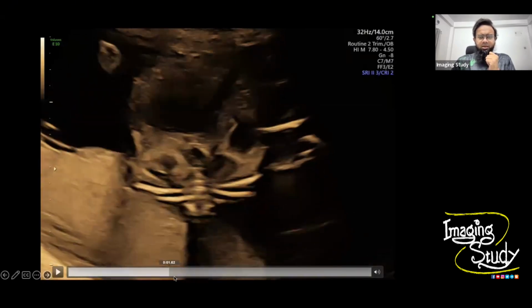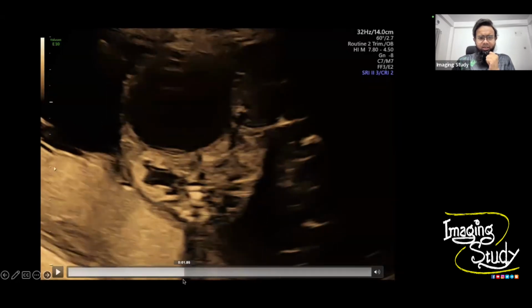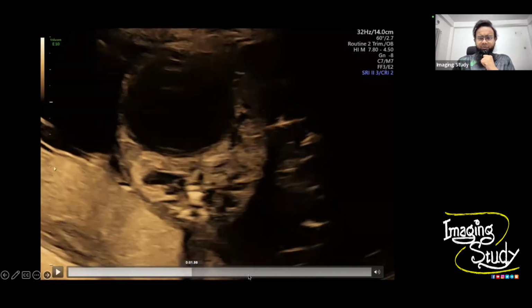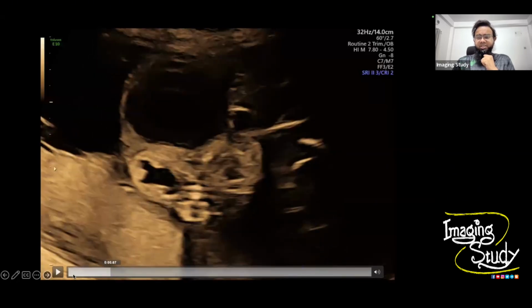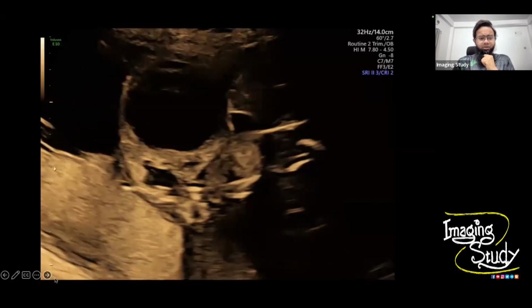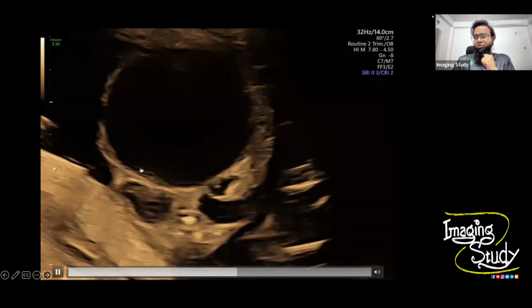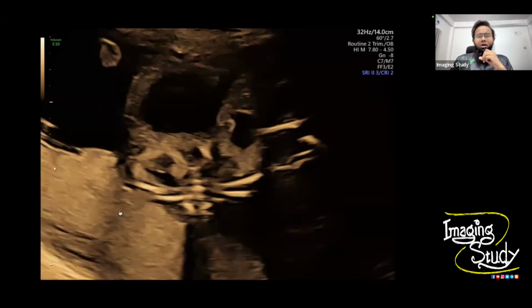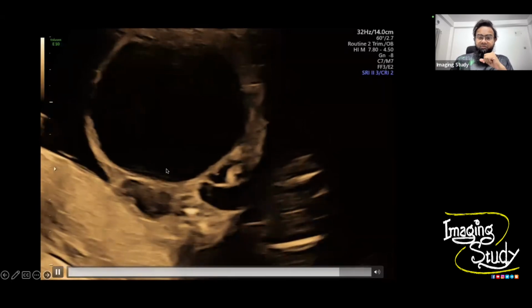The kidneys are not normal. Actually, you see the echogenicity. It's completely echogenic. I will show you the other one, the left one also. So this is not a very good one. The patient is in breech presentation, I think. So anyway, this is quite an echogenic kidney. This is due to the obstructive nephropathy, or obstructive uropathy, whatever you say, due to the posterior urethral valve.